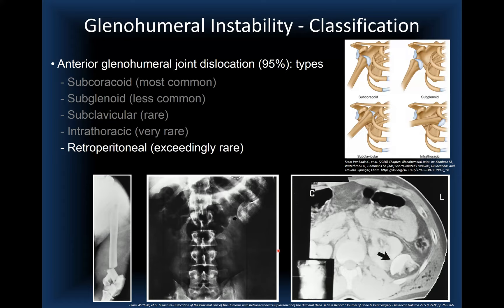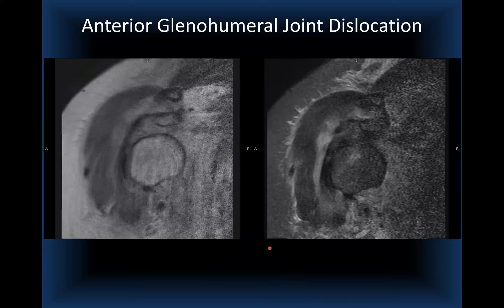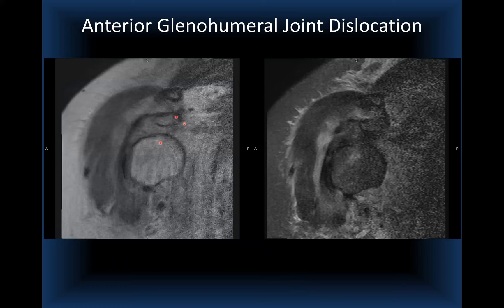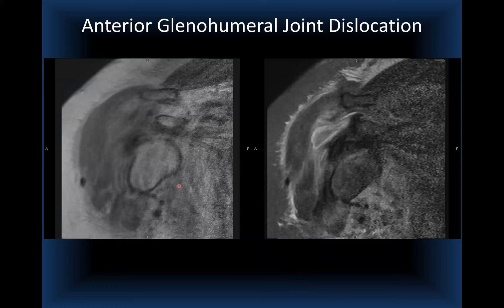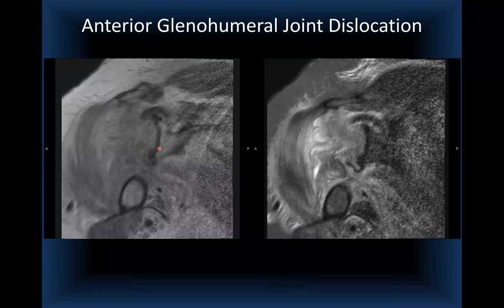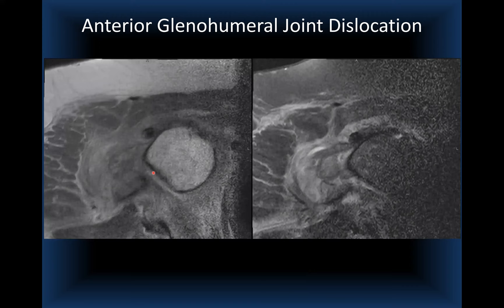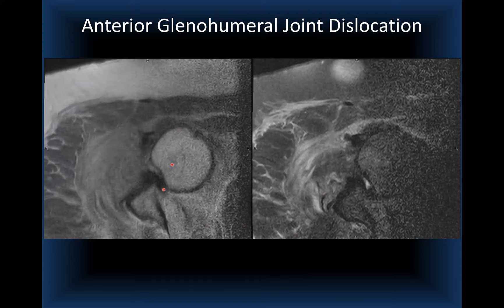We don't usually image dislocated patients on MRI, but sometimes patients present without disclosing a dislocation, or we image them when reduction cannot be achieved in the ER to check for interposed soft tissue or bone. In such a case, as we scroll from anterior to posterior, there is no humeral head at the glenoid because it is located anteriorly, with extensive soft tissue injury including rotator cuff, capsular, and ligamentous tears interposed in the joint.